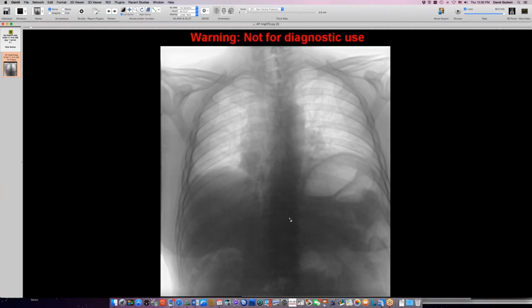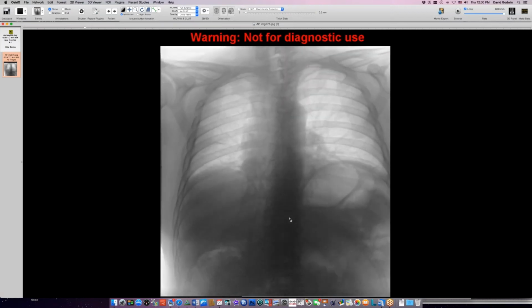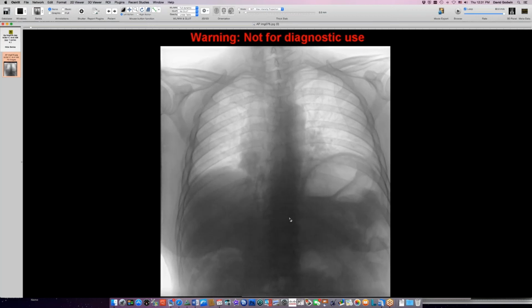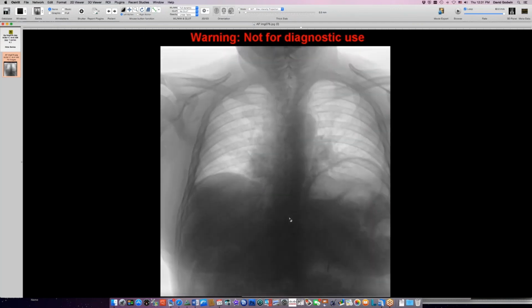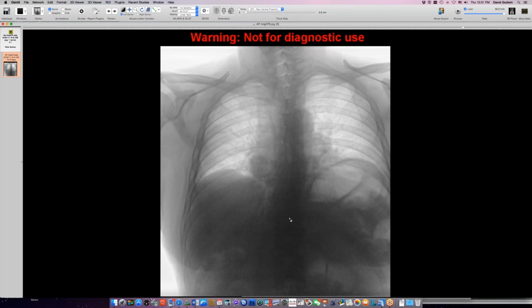This is frontal fluoroscopy, and you can see that there is some motion of the dome of the hemidiaphragms as the person takes in a deep breath. And then this guy got the idea that he had to take a super deep breath, and he started really exercising his chest wall. You can see him throwing his neck back and stuff like that. He thought he was helping by really exaggerating.